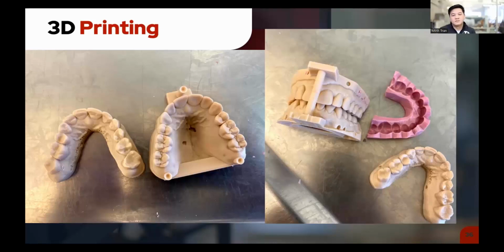So you can do this whole workflow on either the Max or the Pro 4K, but depending on the volume, you may want to look at either getting the Pro 4K or settling with the Max. Absolutely. So this is great.